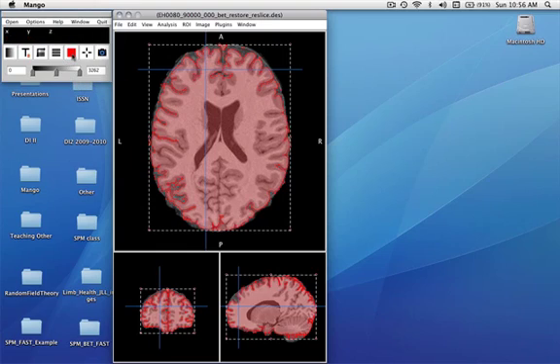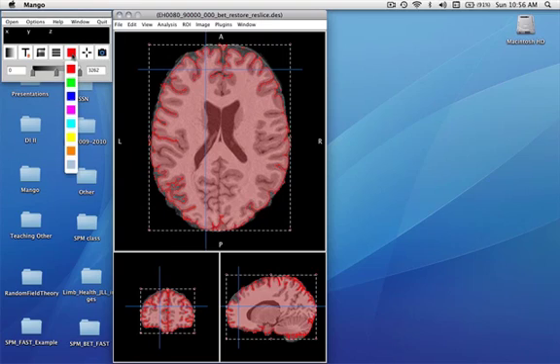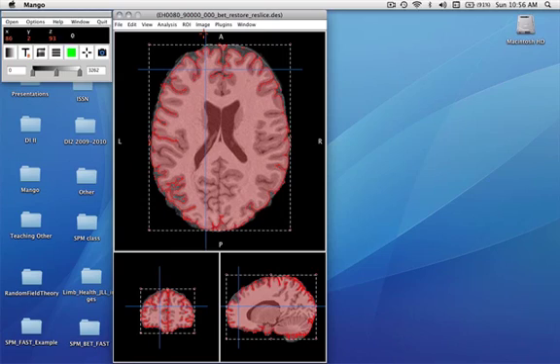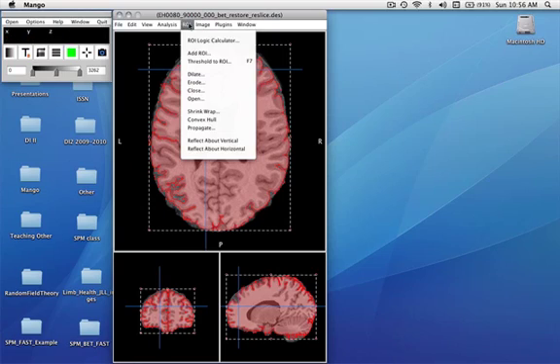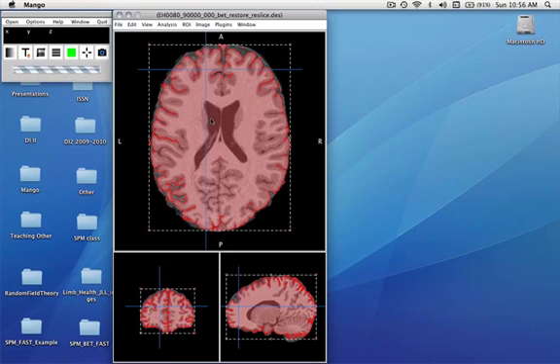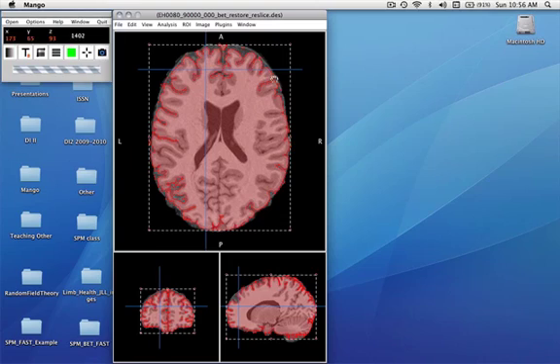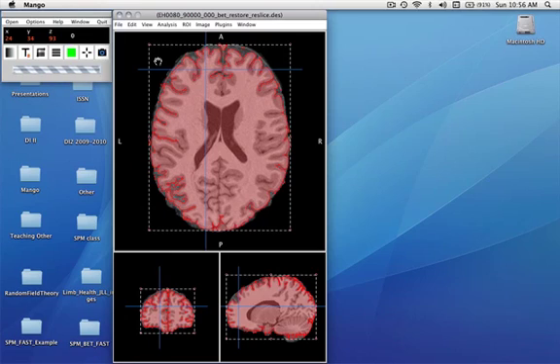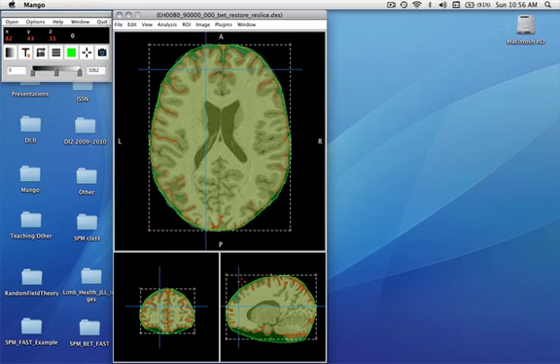I'm going to build another region of interest off of this one. And I'm going to designate it a different color. And this time we're going to make it a convex hull, which is the convex wrapping around the red region of interest. And he'll come up here shortly. There we go.